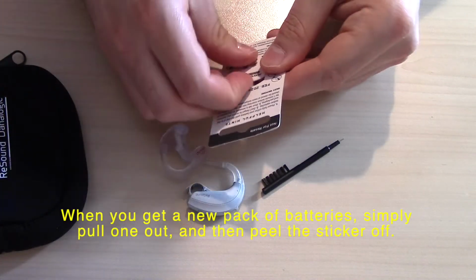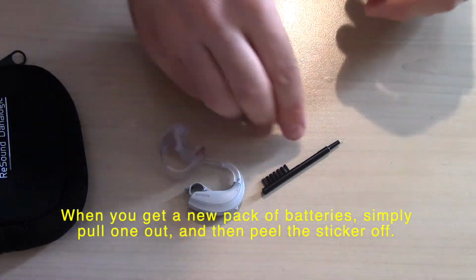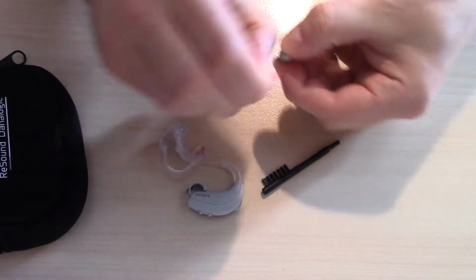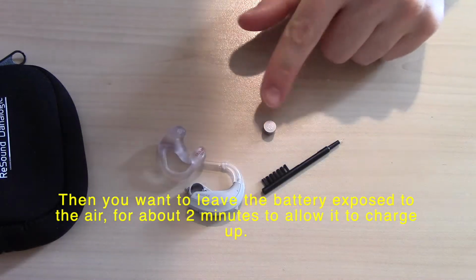When you get a new pack of batteries, simply pull one out and then peel the sticker off. Then you want to leave the battery exposed to the air for about 2 minutes to allow it to charge up.